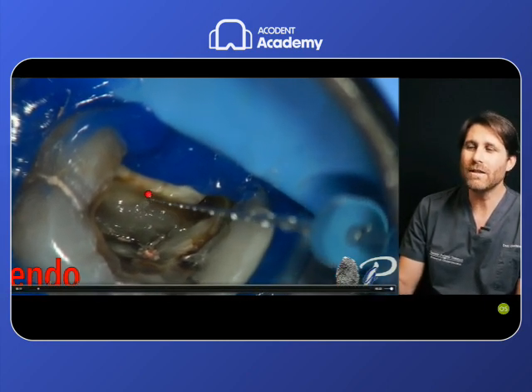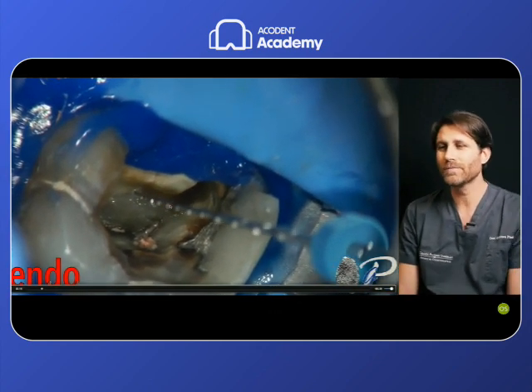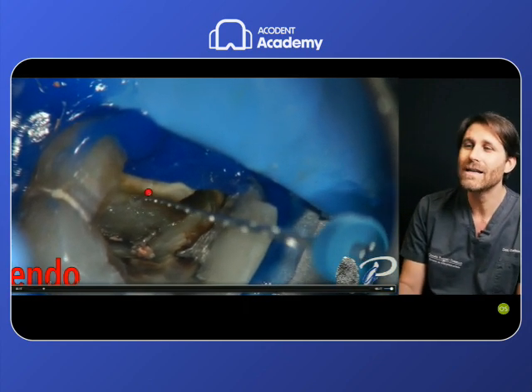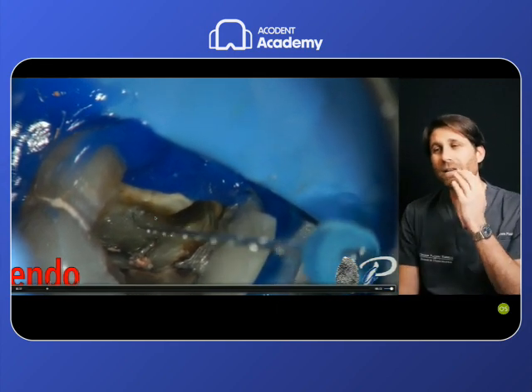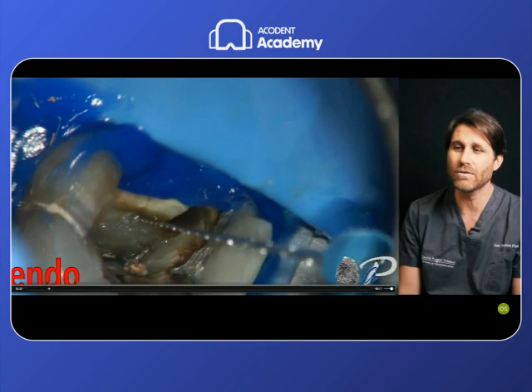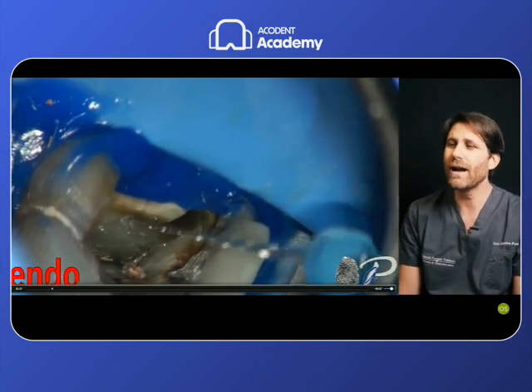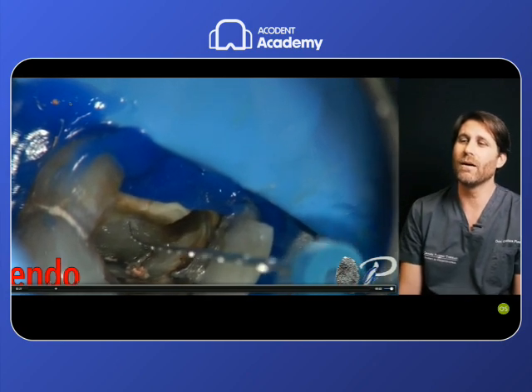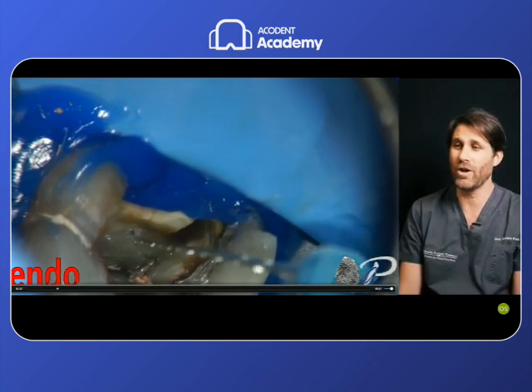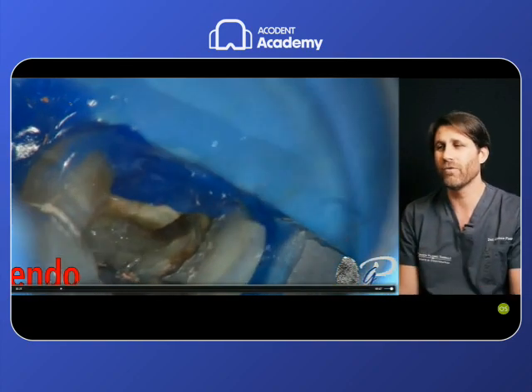I found an invitation. I tried with a small glide path file in reciprocation, but this small file does not have the power to penetrate this dentin. There is an invitation, but this invitation is closed. This orifice is closed. There is not space for this file to penetrate this orifice and this trajectory. So the small file has not the power in its tip to perform it.